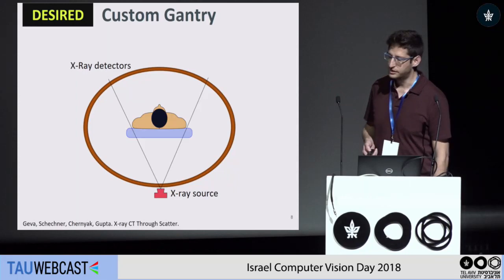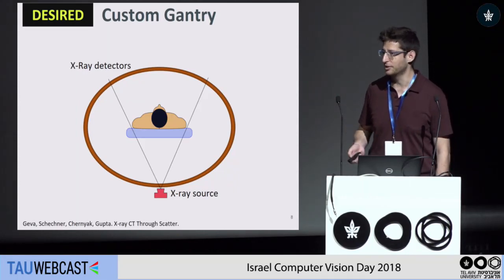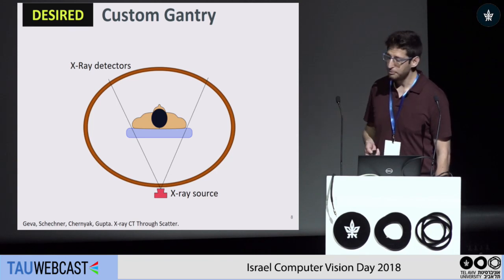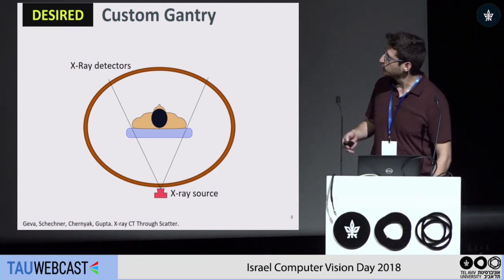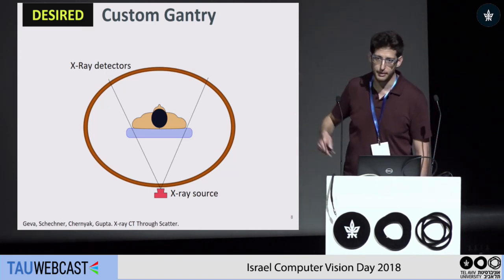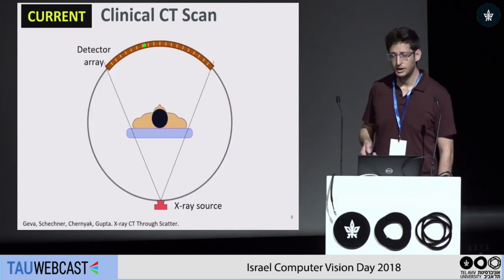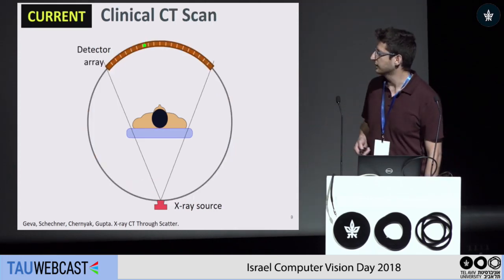The traditional circular shape of a CT is not necessarily the best fit for our human shape, right? An elliptic shape would fit better. It would be more compact and would also enable reducing the radiation when projected along the minor axis. However, do you think this is possible? Let's focus again on the traditional setup.